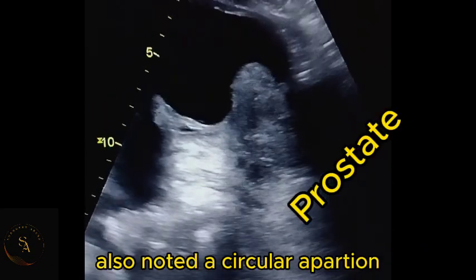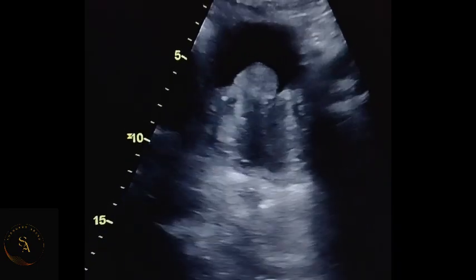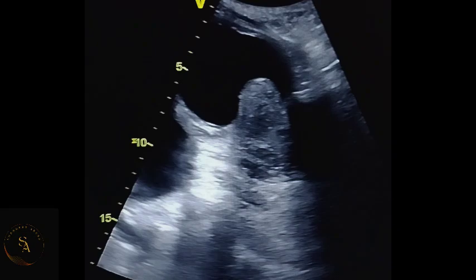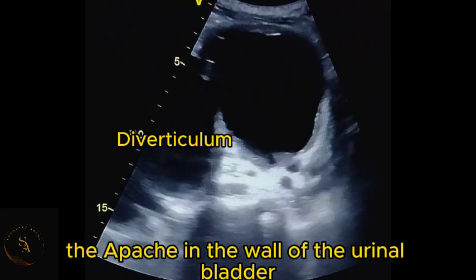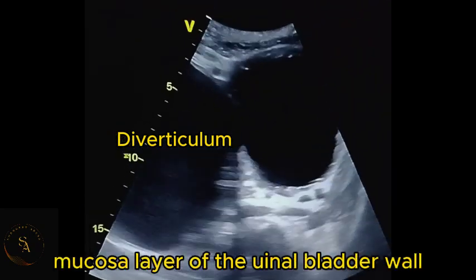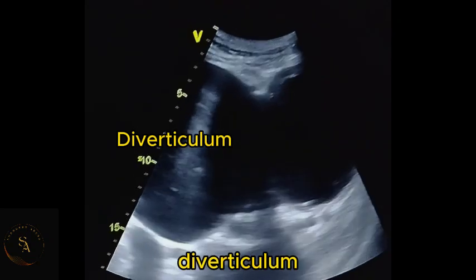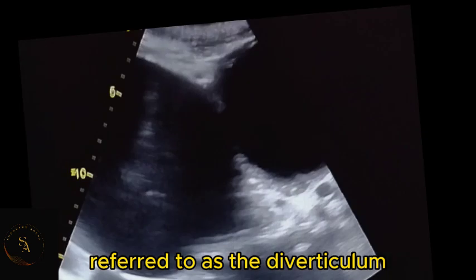We also noted a circular outpouching from the wall of the urinary bladder with a connection into the urinary bladder. The outpouching in the wall of the urinary bladder represents the herniation of the mucosal layer of the urinary bladder wall through its muscular layer, and this is referred to as a urinary bladder diverticulum. The circular outpouching is referred to as a diverticulum.